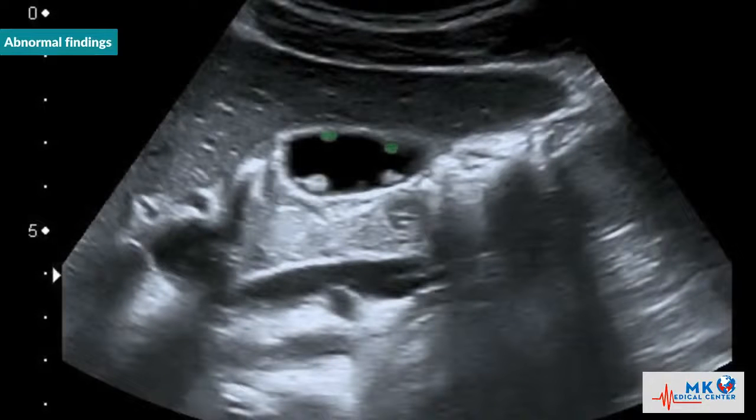Polyps are outgrowths of the wall and therefore not mobile. They also do not usually have an acoustic shadow.